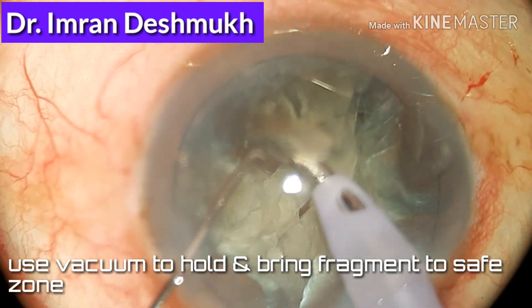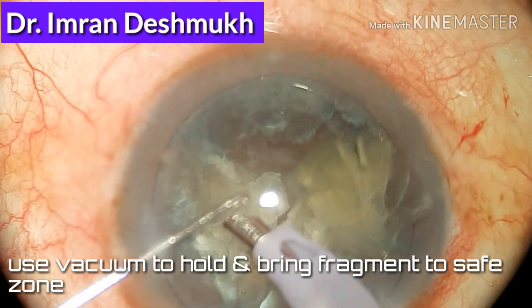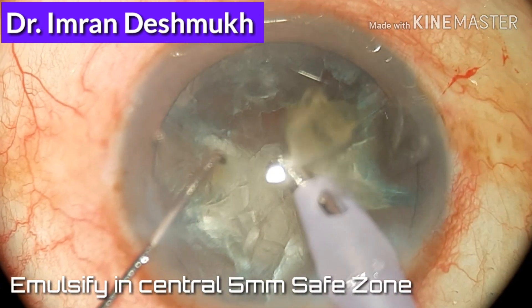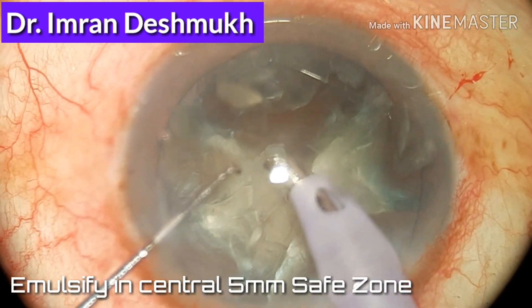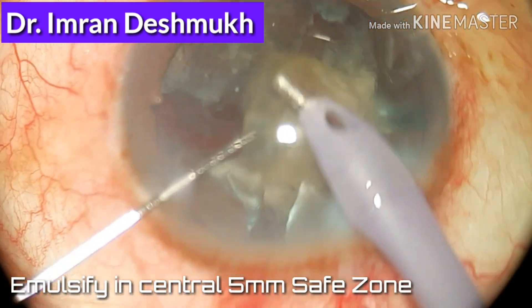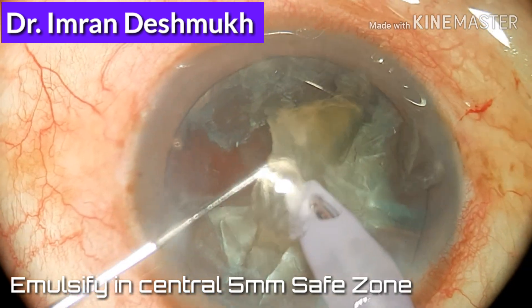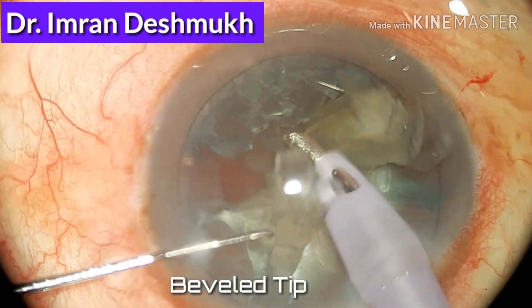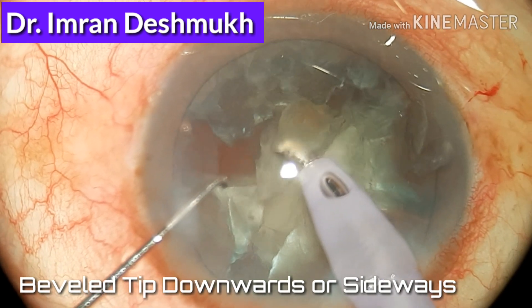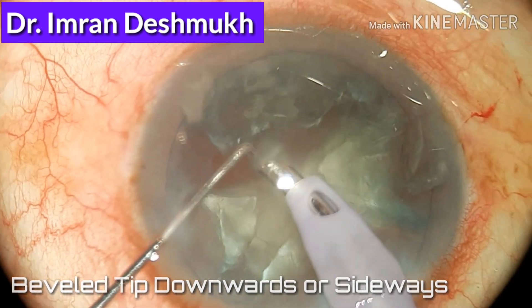What is important is to grab the nuclear fragments with the help of vacuum, bring them to the central safe zone, and emulsify. Always emulsify in the central five millimeters of the safe zone. Do not emulsify nuclear fragments in the periphery, as that can lead to complications.